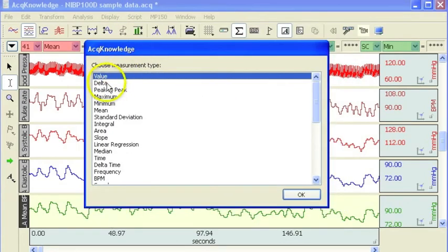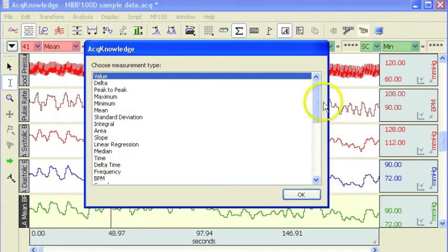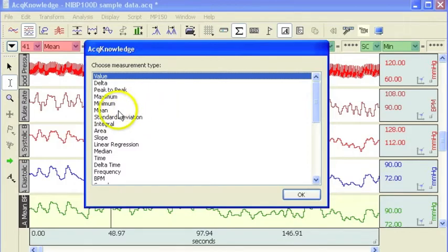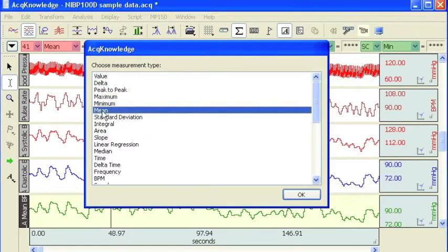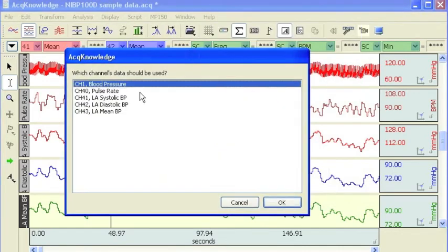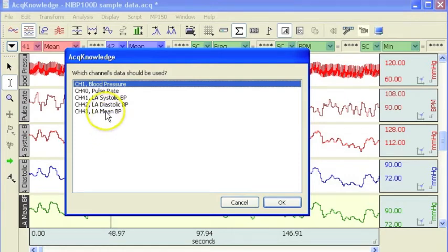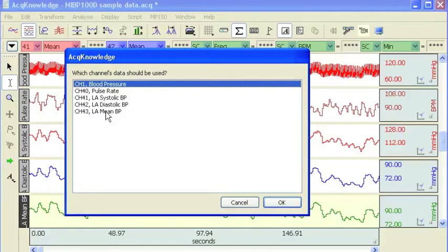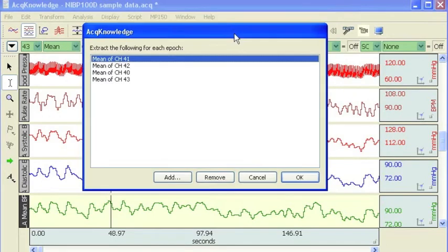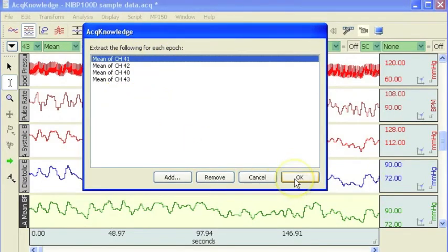Basically you have the same list of measurements that are available from the pull down measurement boxes that appear above the graph window. And again if I just select mean, we are then asked to choose the channel we want to take the mean value from, and I am going to select the mean blood pressure, so we will get the mean of the mean blood pressure over a 10 second period. So now we have got four different measurements selected on four different channels.